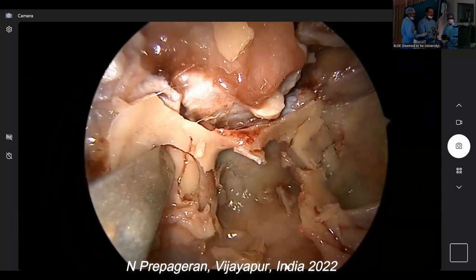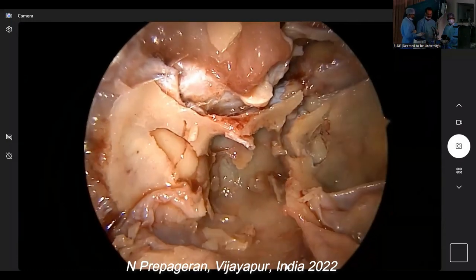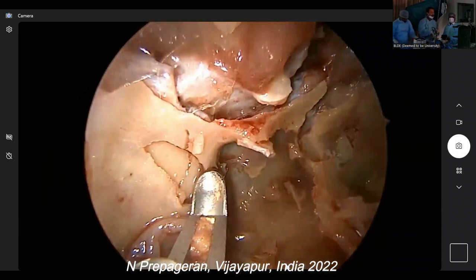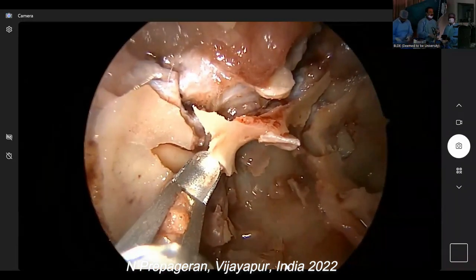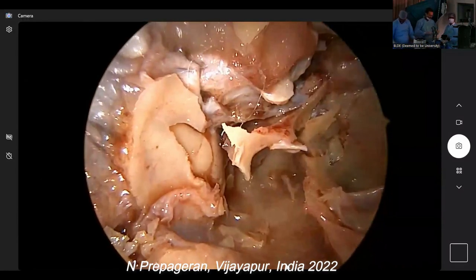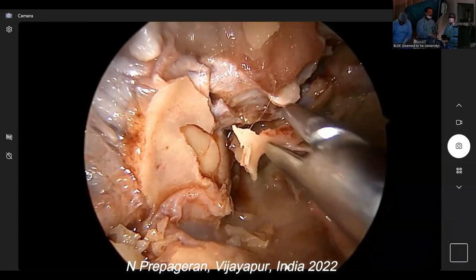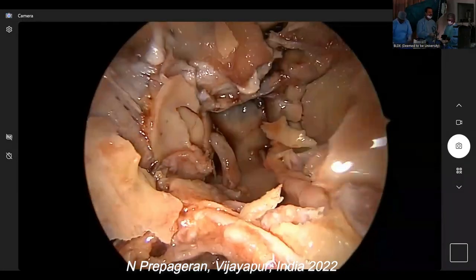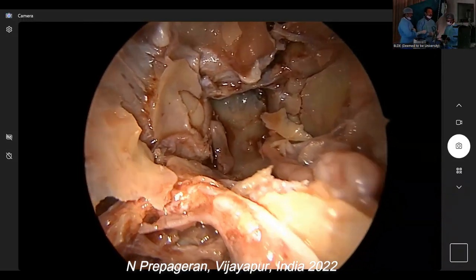What is this? Carotid artery. Correct. That's a paraclival, yes. Carotid. Yes. So now I got a space. We will remove. Beautiful. Shashi, clap for him again. Nice. Very, very nice. So now we are going to remove. This is the lower part of the clinoid of the sella. Okay. So where is this now?